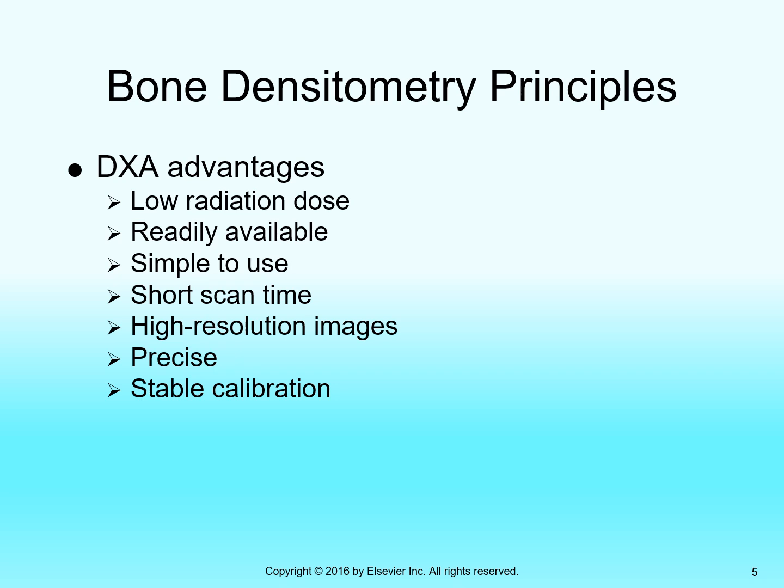And so the physics is consistent. If we get a difference of exposures in the remnant beam, that is, the strength of the remnant beam displays variation, we can attribute that variation to the difference in energy. Okay, and then we can make some mathematical assumptions about the tissue density and type, that is, is it calcium, or how much of it is calcium, and make some really, really accurate predictions with a stable calibration machine.